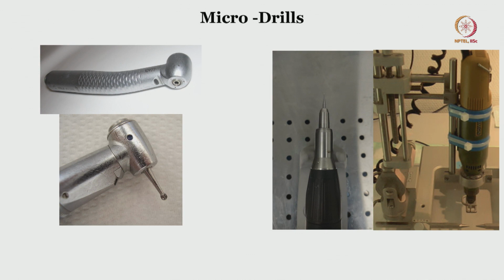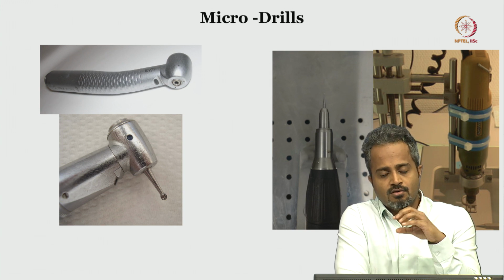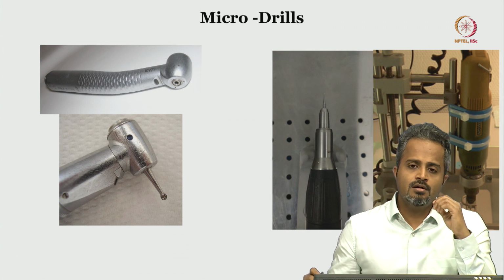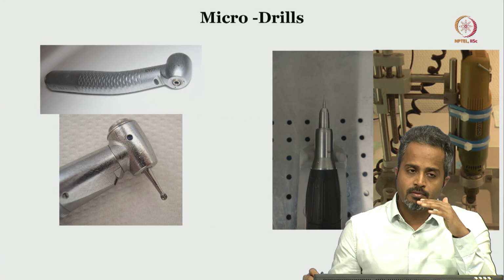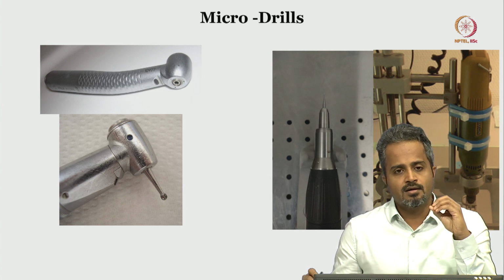Once you decide where to open up the skull, the next very important step is the drilling. You need to remember that the skull is a thick structure, and underneath it there is a jelly-like structure, the brain. In between the skull and the brain, as you all remember from the previous session, there are numerous cortical veins and arteries.